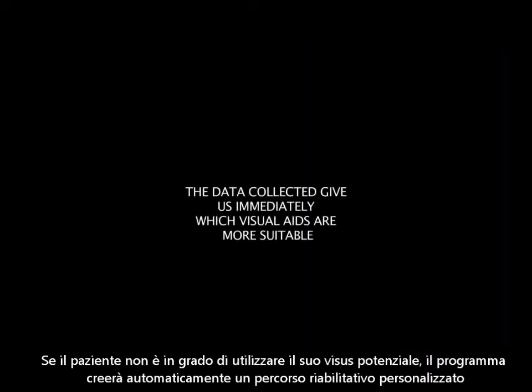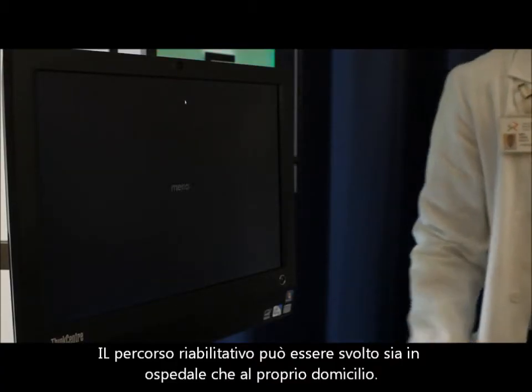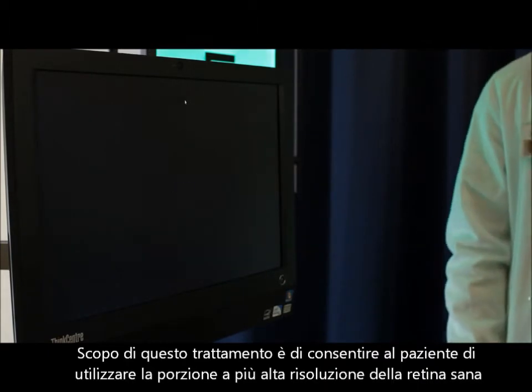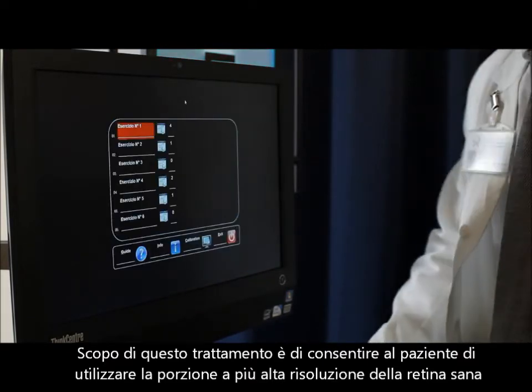This data allows us to offer the patient the best exercises, which present a series of words flashing on the computer screen. The purpose of these exercises is to teach the patient how to use the portion of the retina that can offer better performance.